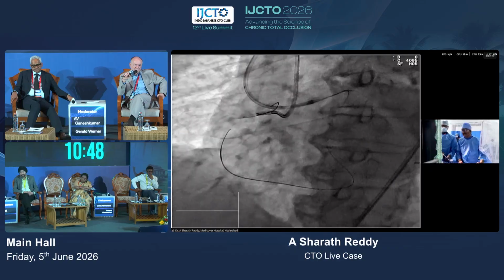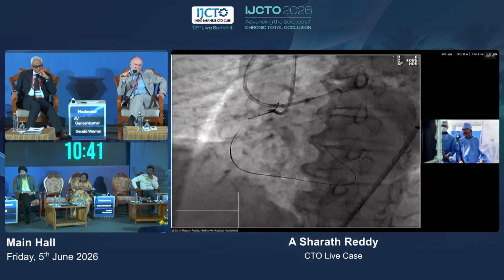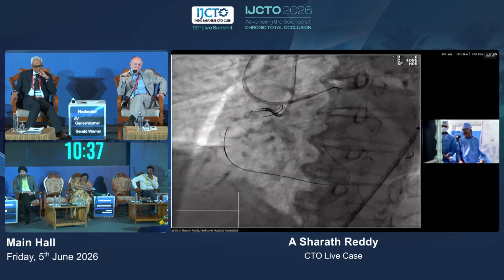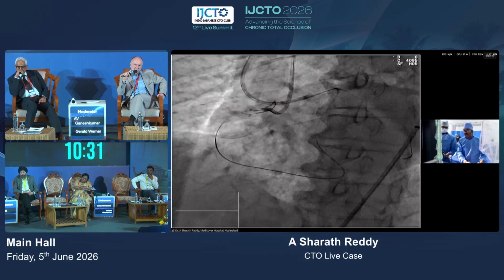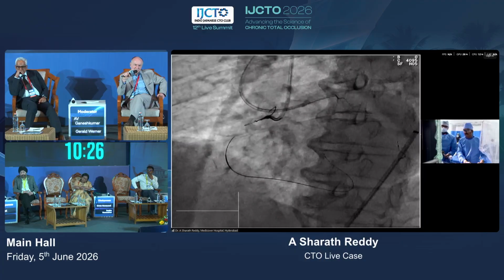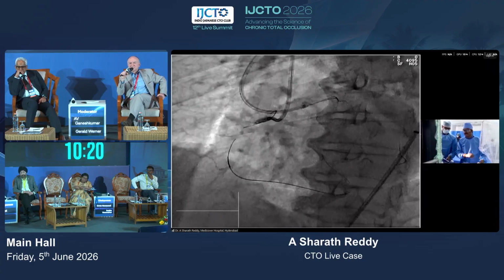Yeah, actually, as Sudhir mentioned, the BASE technique is very nice. What I mean by that is probably a 1.5 millimeter balloon for the side branch inflation, halfway in the side branch and halfway in the supposed proximal cap. And then you can advance a polymer jacket wire while inflating the balloon, because that prevents the migration of the knuckle wire into the side branch.